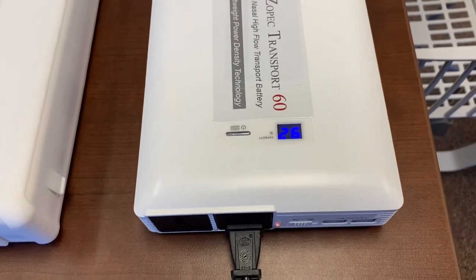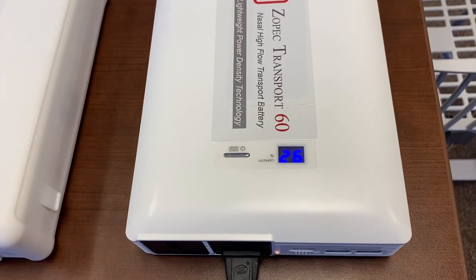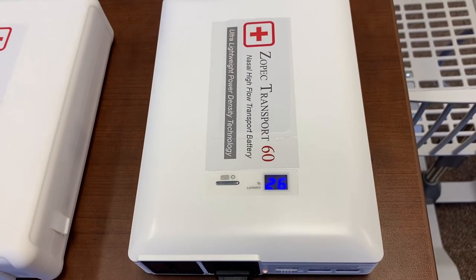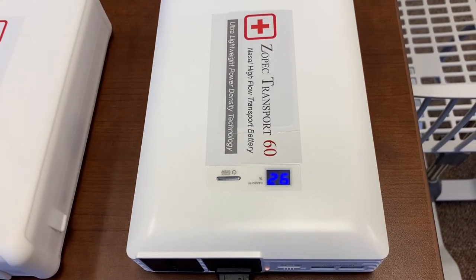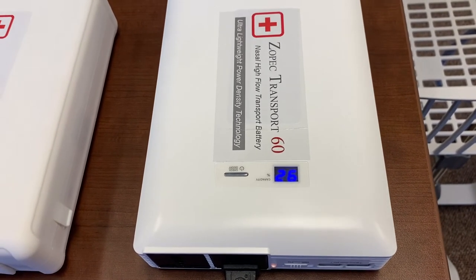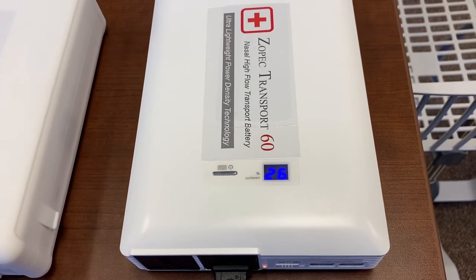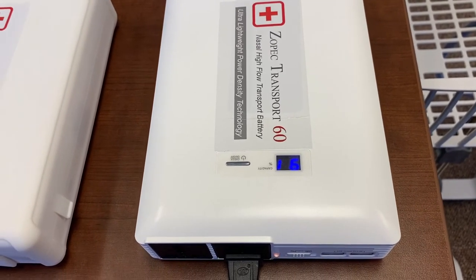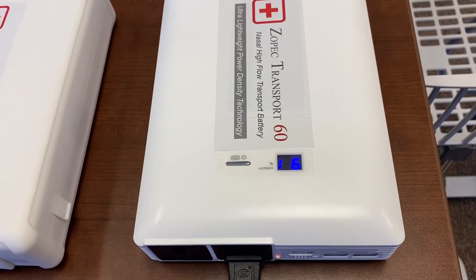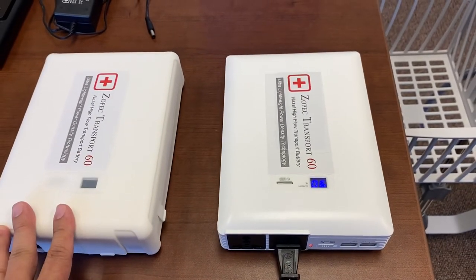For FAA compliance, you can bring two Transport 60 batteries per person. That means you have the patient — that's two batteries — a pilot, that's two more, and so on. Air ambulance crews who need two hours, for example, will link up two batteries in order to get two hours.